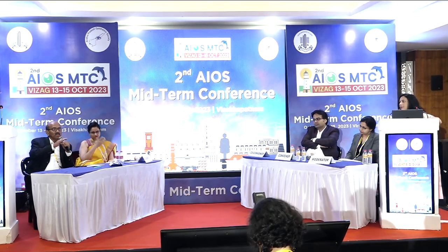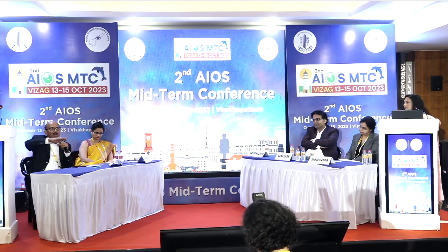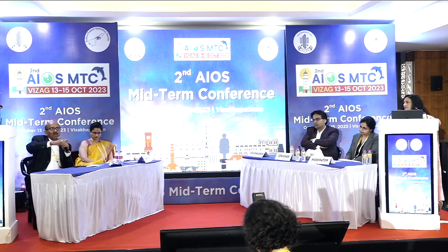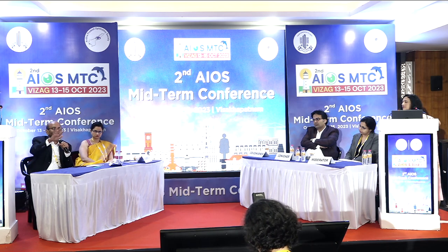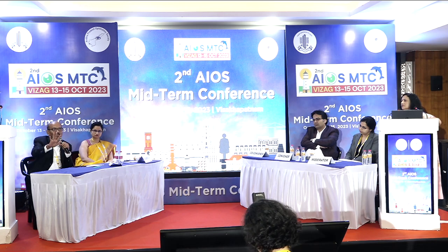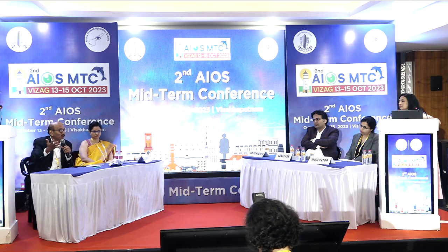See, the haze is proportional to the power. If you ablate more power, there are more chances of haze. In those cases, you have to prolong your steroids. But not common, rarely. In my experience, I have seen 5-6 cases going into frank glaucoma. The explanation the glaucoma people give is, he is a highly steroid responder.